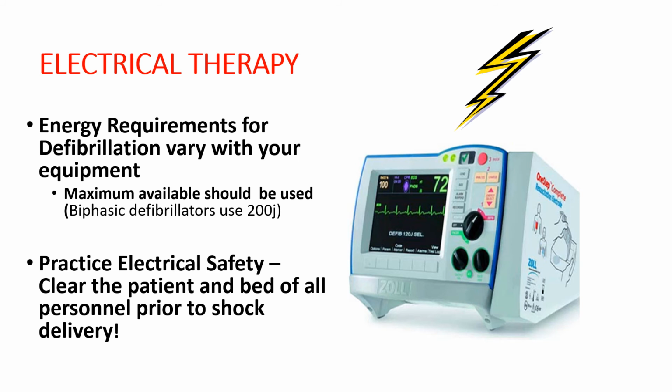If you deliver that shock and somebody is touching the bed the patient is on, that electricity can travel through the patient, through the bed, and to the other person until it hits ground. Unfortunately, it can injure the person, or it can stop their heart, because again, what you're doing is stopping the heart and resetting it. So always practice electrical safety when defibrillating.